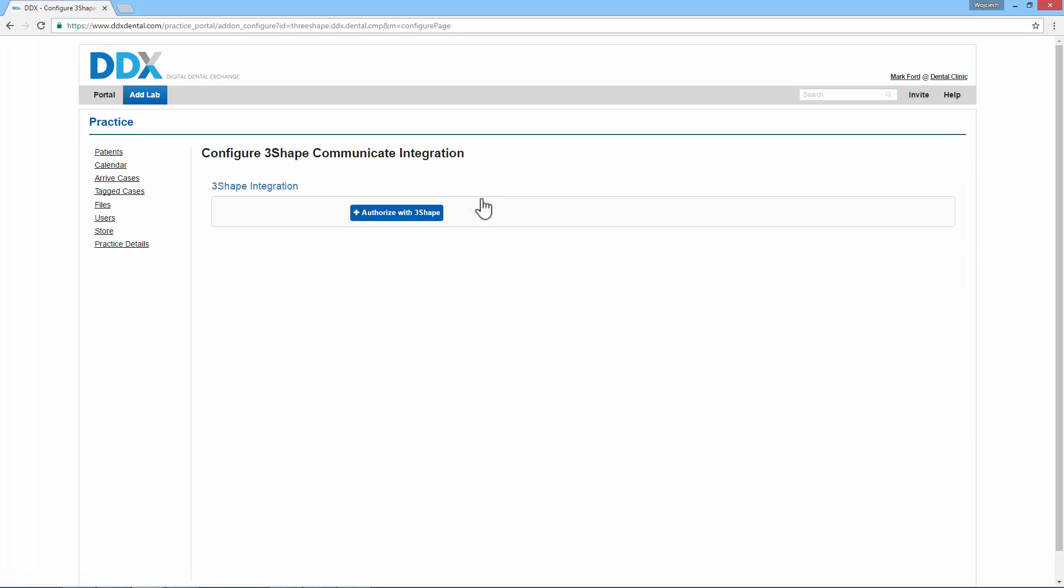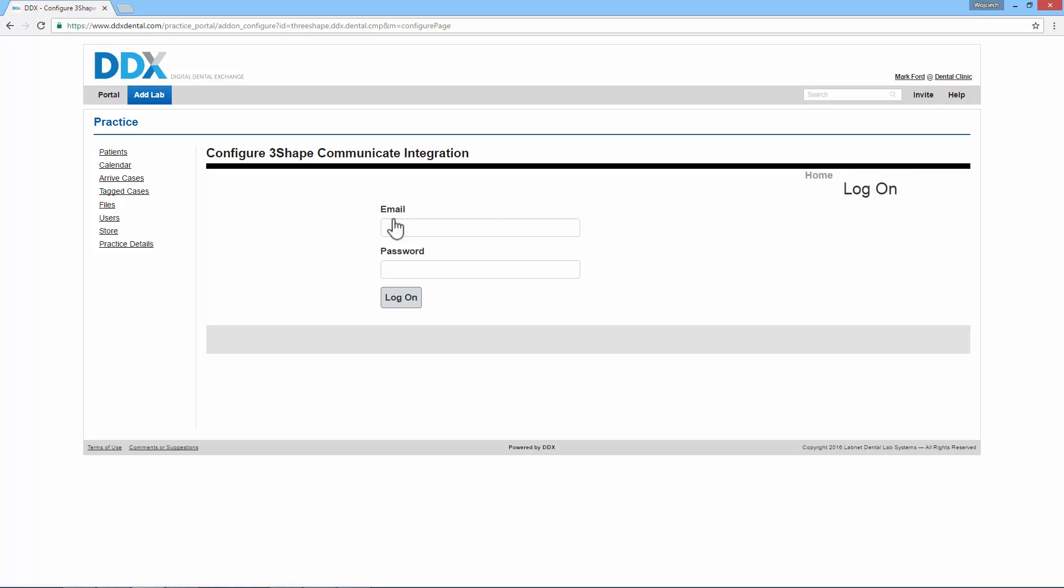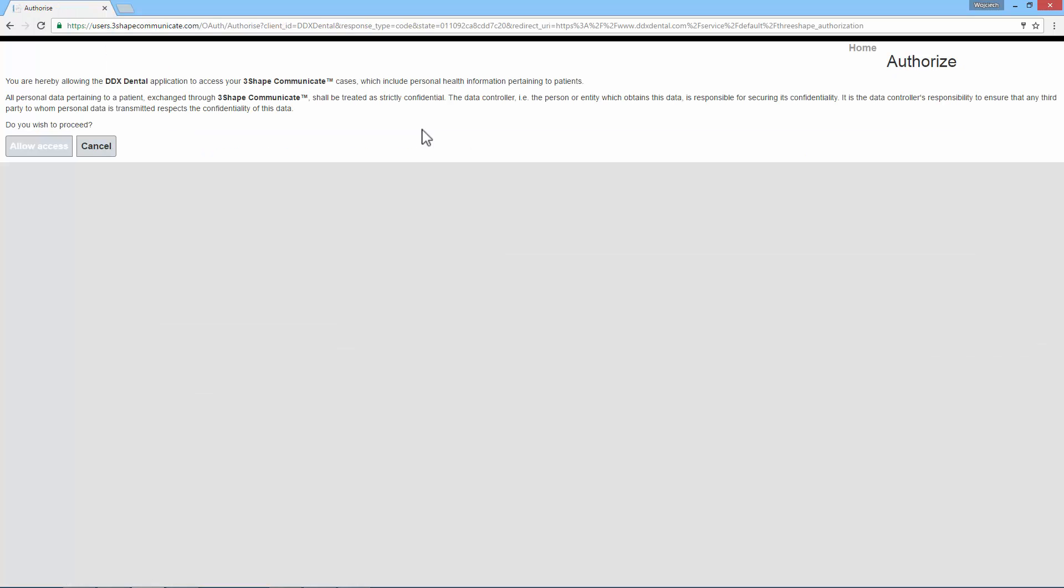Next, click the Authorize with 3Shape button. You should now fill in your 3Shape Communicate credentials and click Log on. After that, the notification will appear. Click the Allow access button on the left.